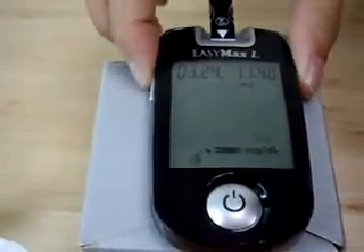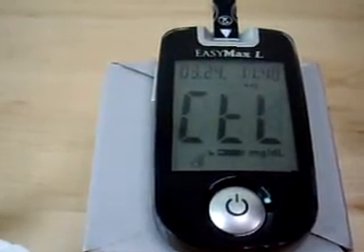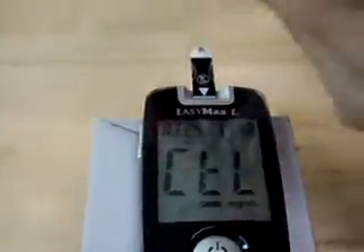Then press the button on the left side of the glucose meter. There is CTL shown on the screen. Next, rub the control solution bottle between the palms before usage.